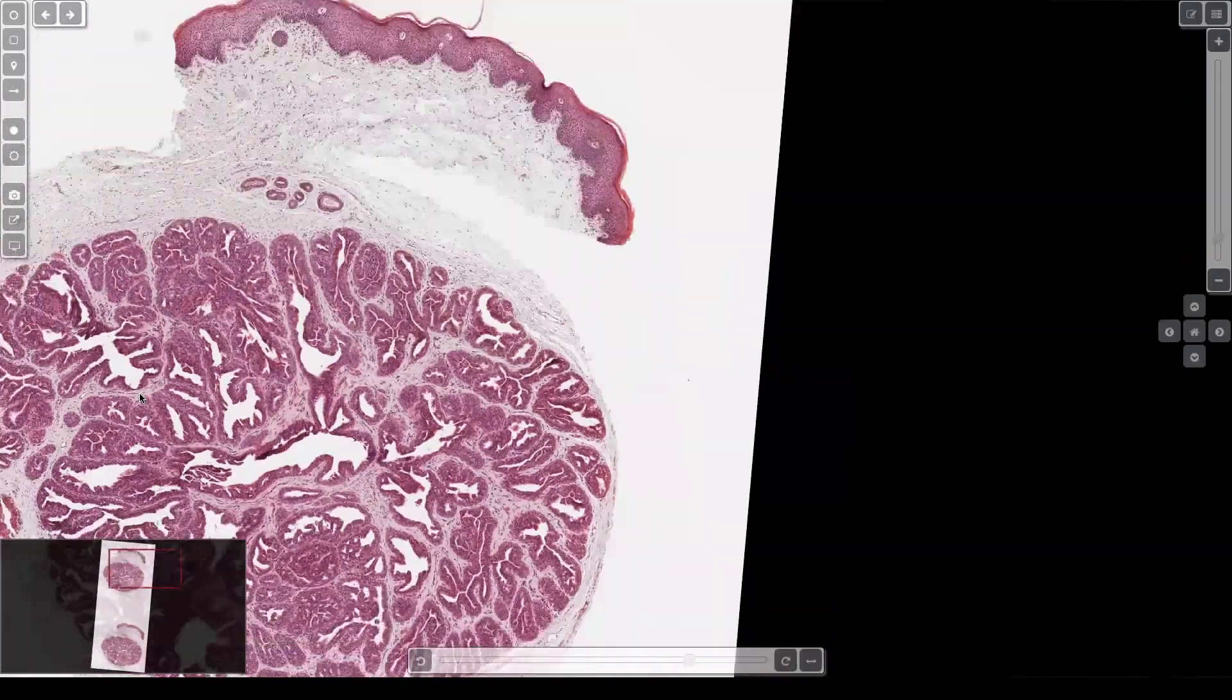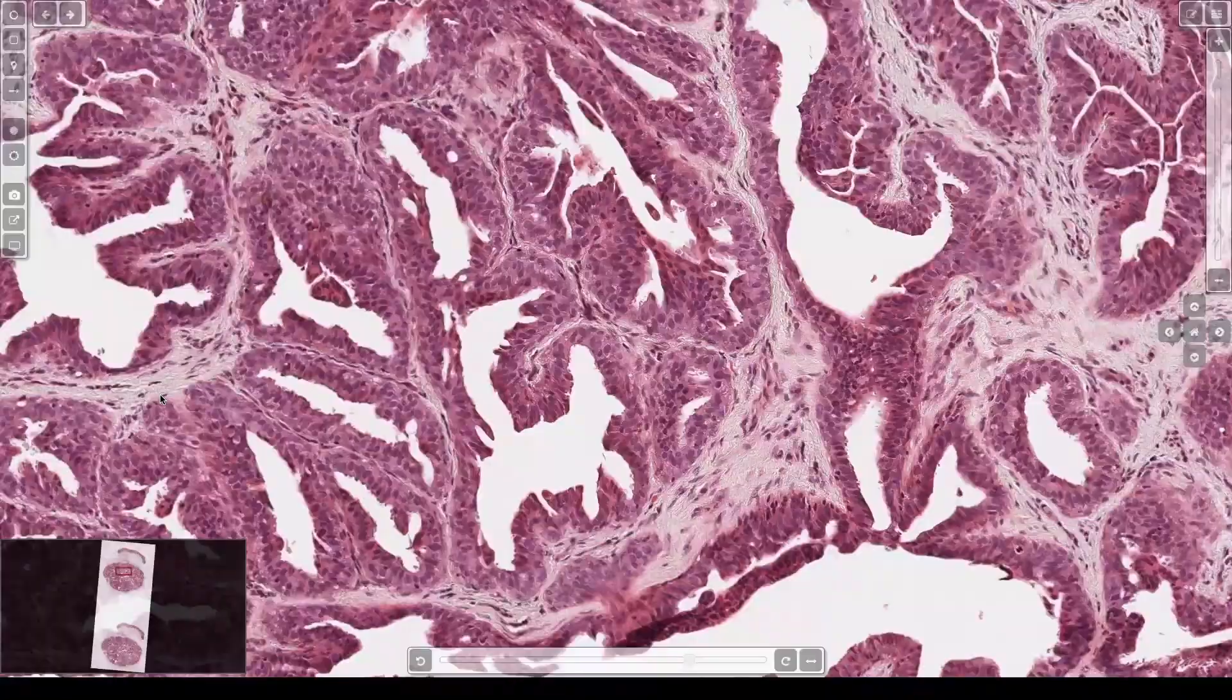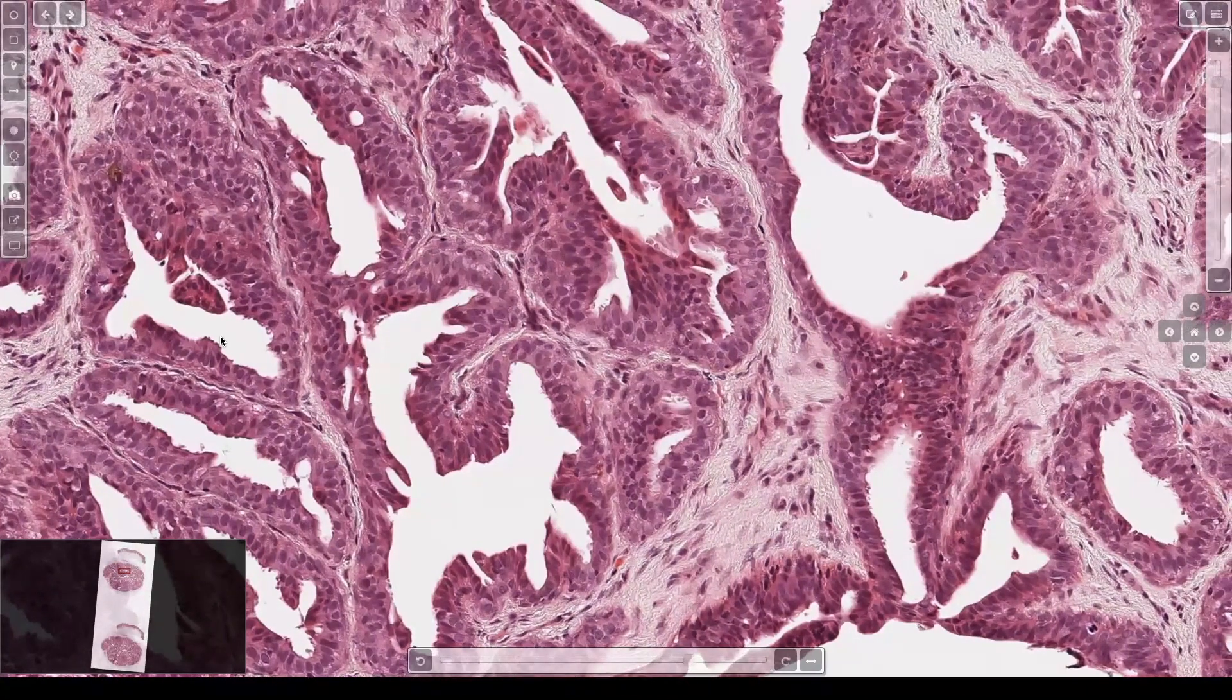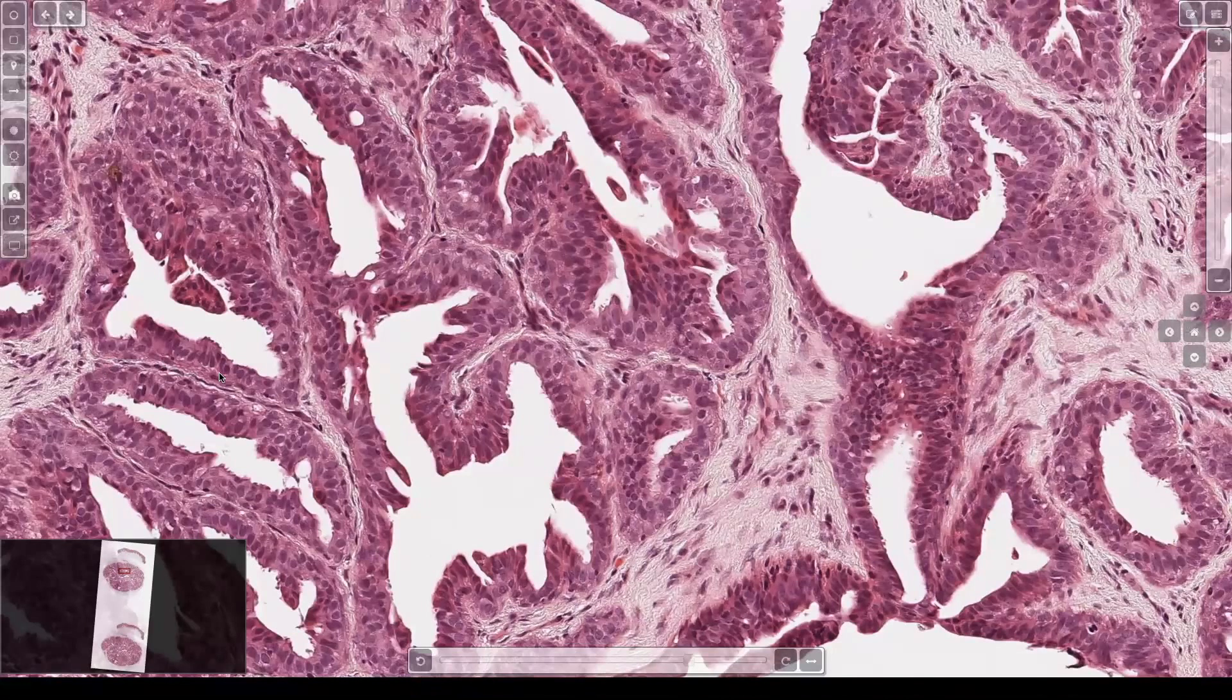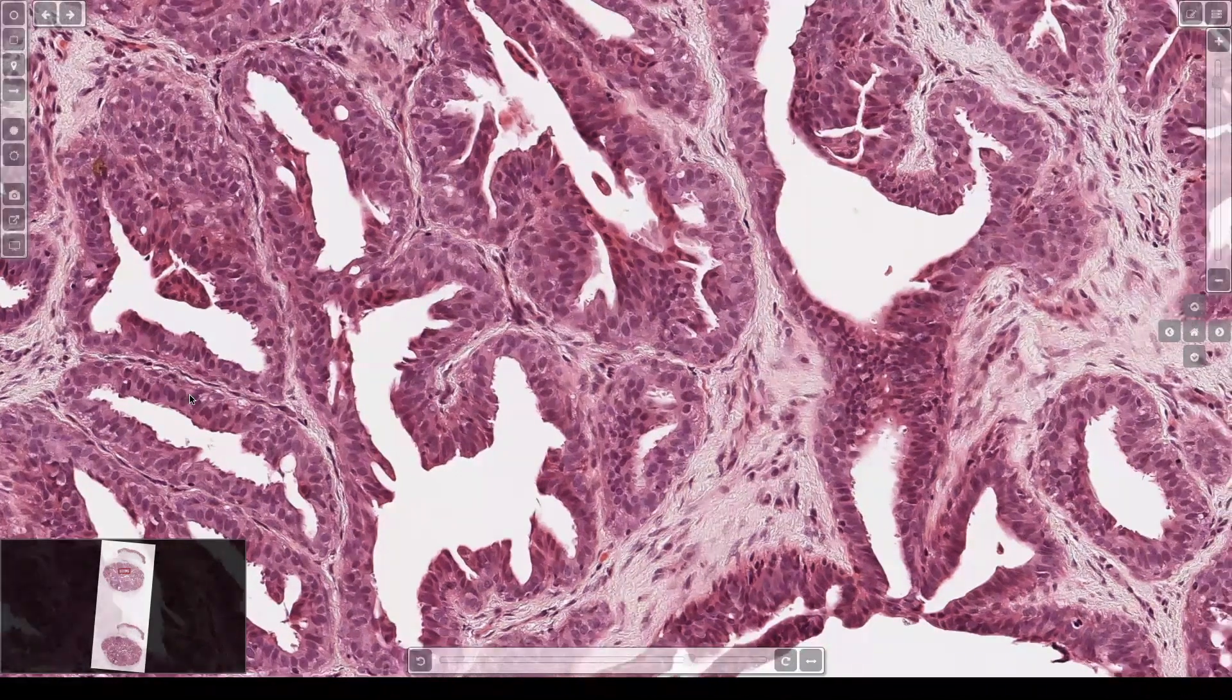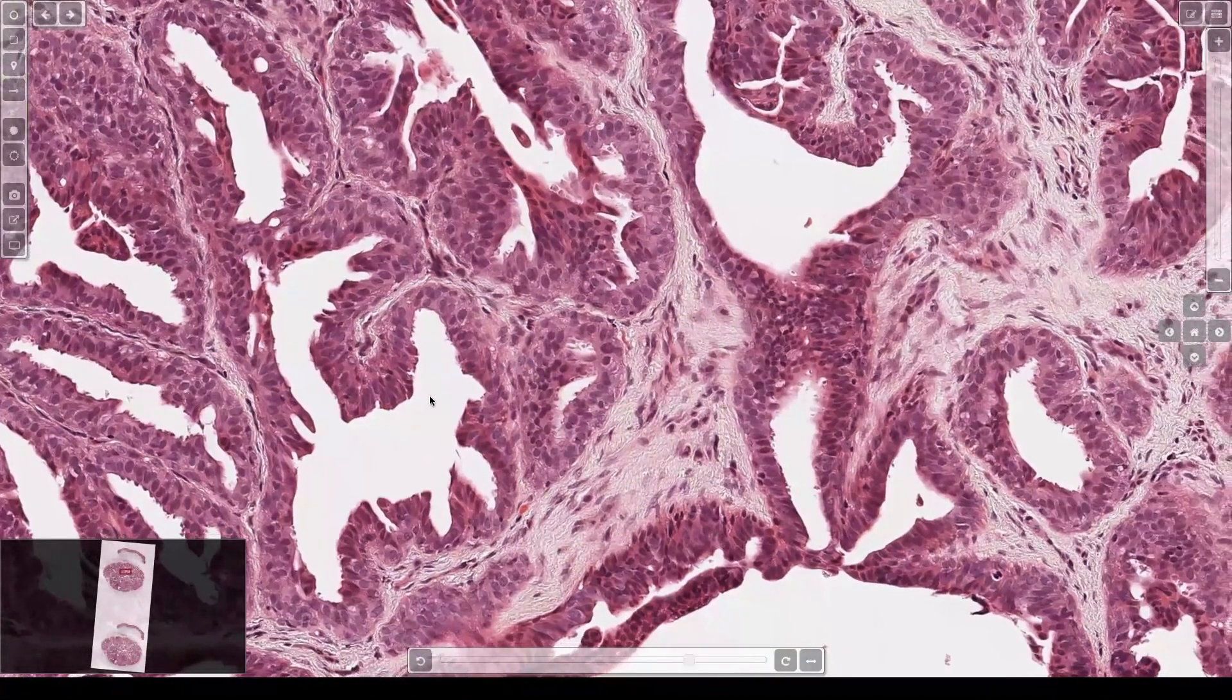And if you look closer at the lining cells, you'll again see that same thing that we saw in SCAP. I think there's a lot of overlapping between this lesion and syringocystadenoma. You'll have the inner columnar layer with little apical tufts or snouts, and an outer basaloid layer that's usually got myoepithelial differentiation.